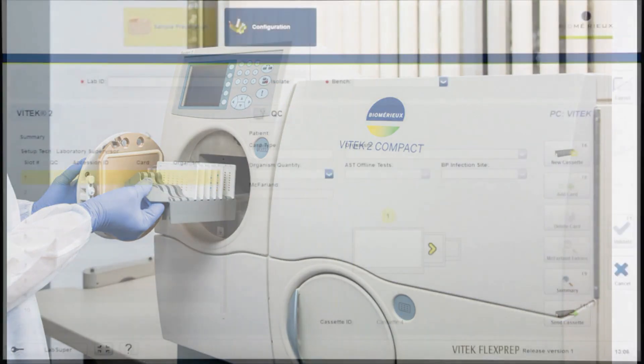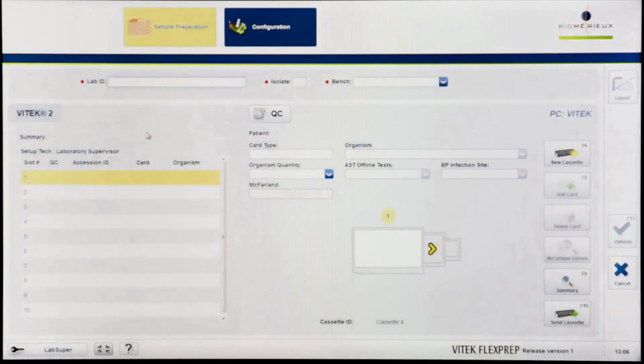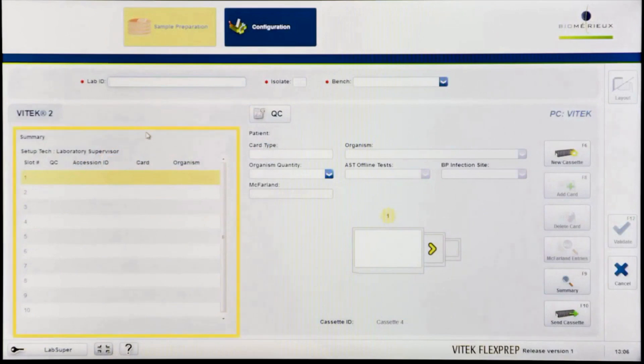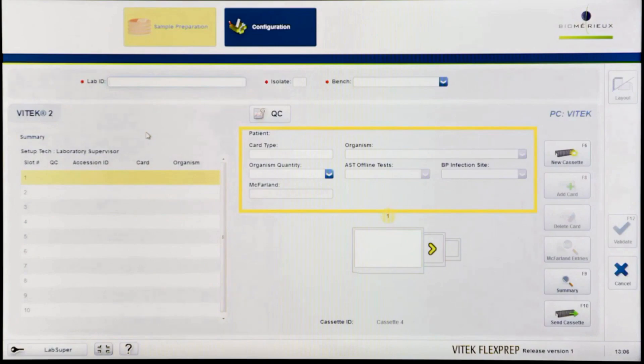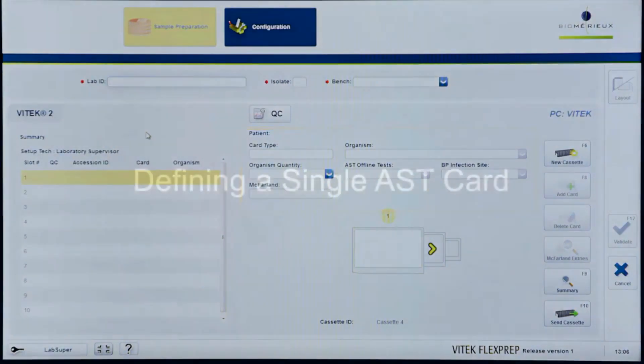The cassette definition screen consists of a summary pane depicting the high-level details of the ten slots in each cassette. Additionally, the screen contains the isolate definition section where information about an isolate and its associated cards is entered.